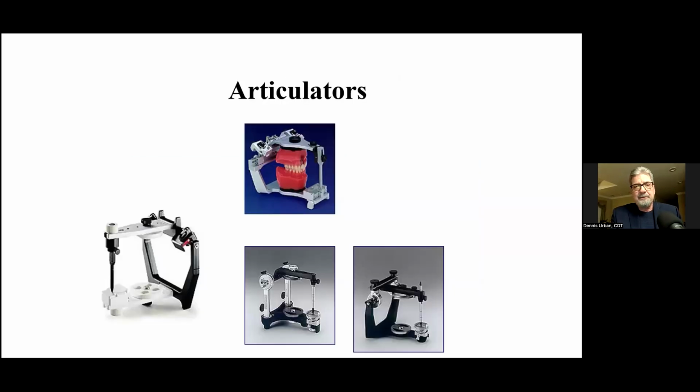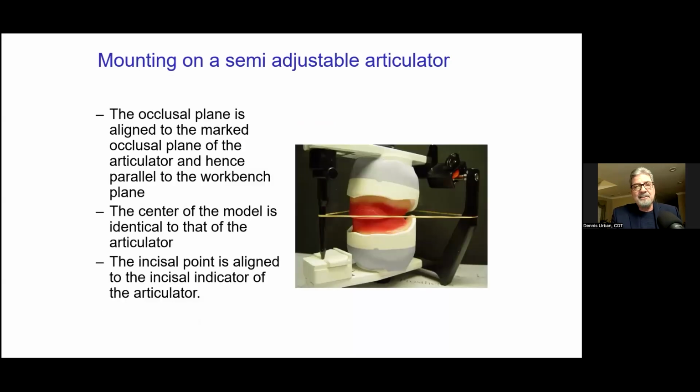And then you have your Denar, Whip Mix, Artex. There are a lot of articulators to choose from when you're talking about using a semi-adjustable or fully adjustable articulator. And what's great is we're going to be using a virtual fully adjustable articulator when we go to design our digital dentures. So we're mounting on a semi-adjustable articulator.